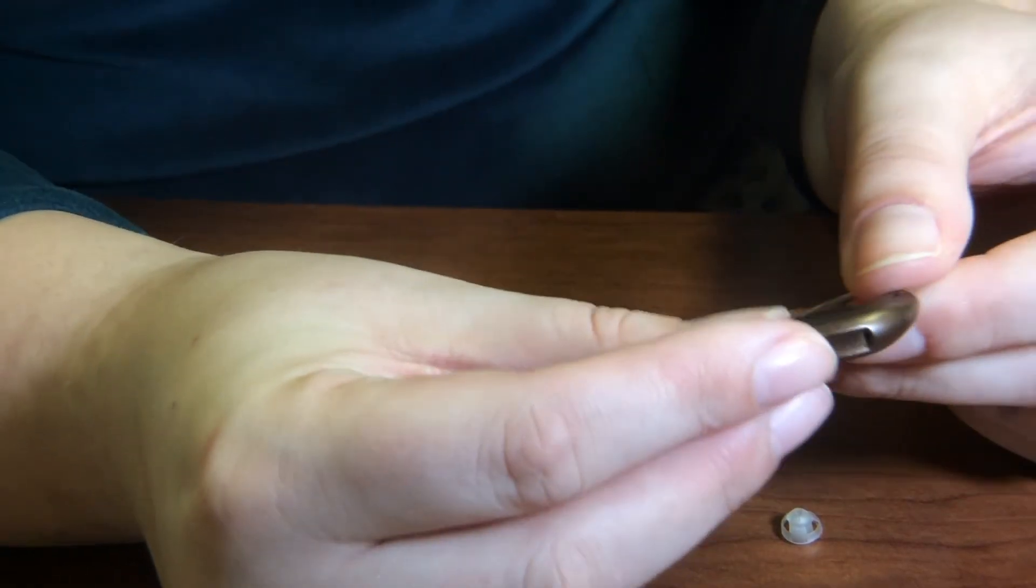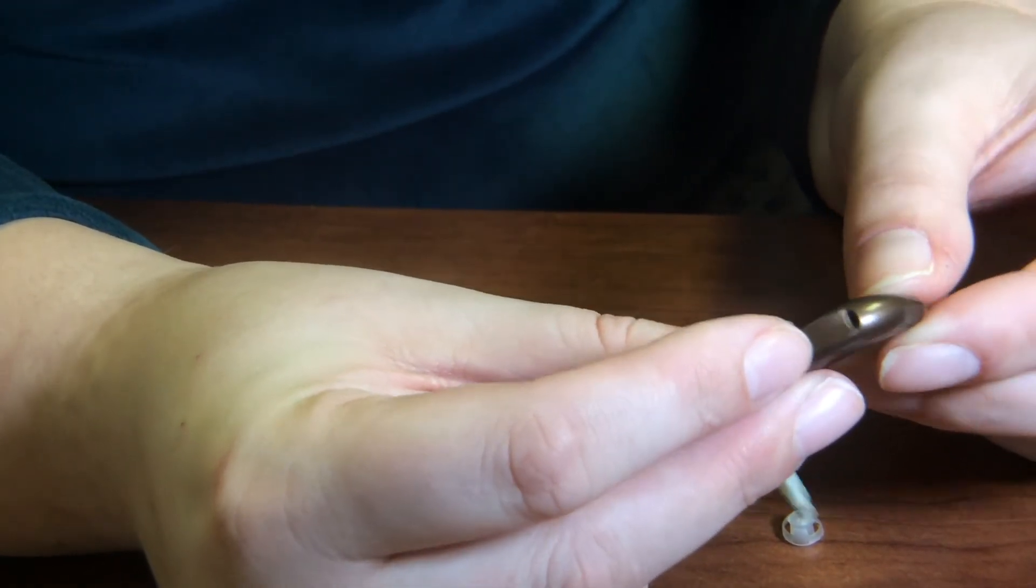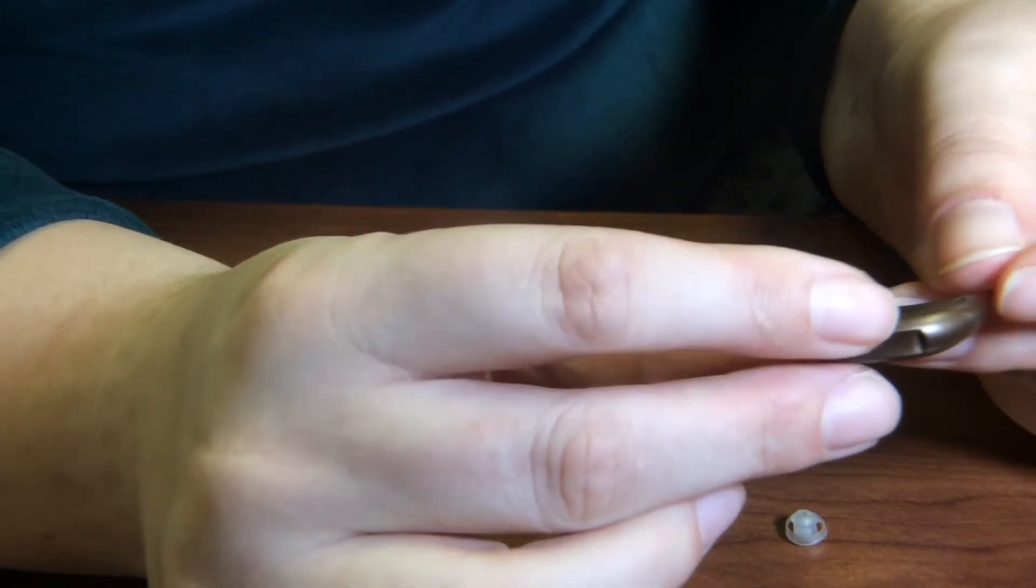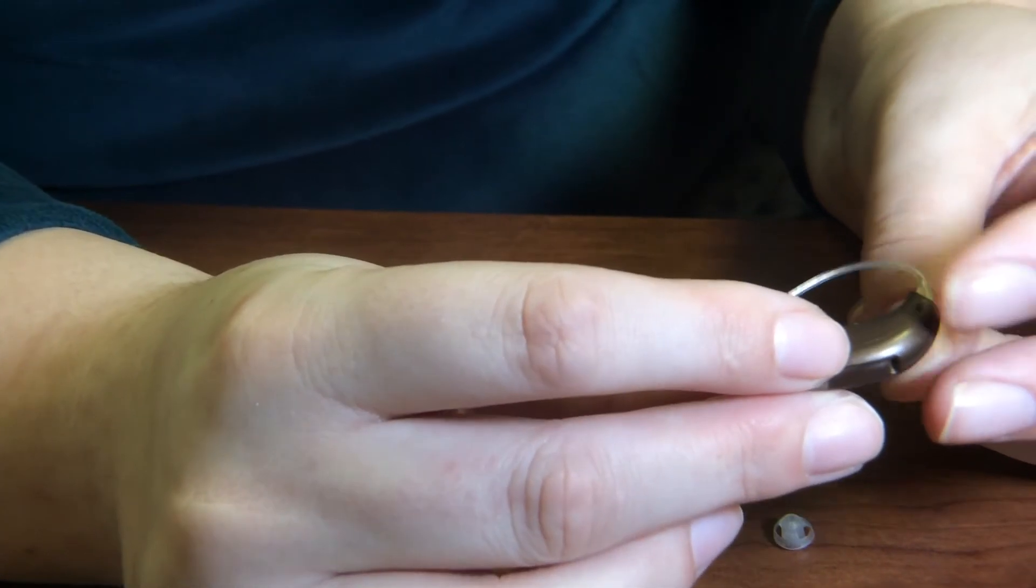And then on the body of the hearing aid, we want to make sure that there is no built-up debris, that the button can depress appropriately, and that there's no cracking in the shell.